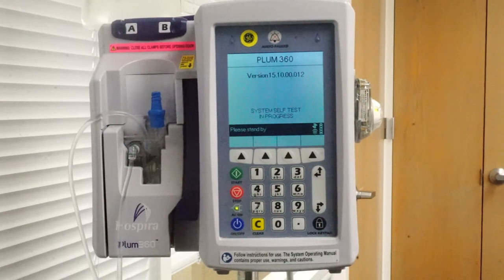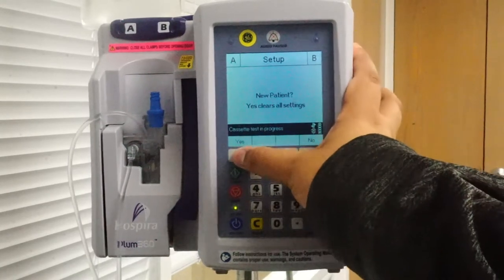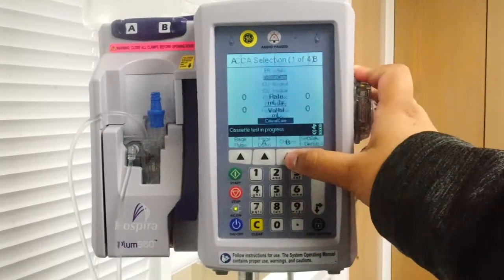Hey everybody, welcome back. In today's video, I'm going to be showing you how to change the post-infusion rate on your pumps. And I'm also going to be showing you how to zero your pumps. So essentially, I'm going to go ahead and add a new patient. We're going to be in the critical care department.